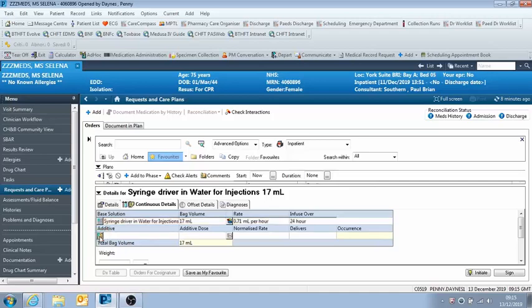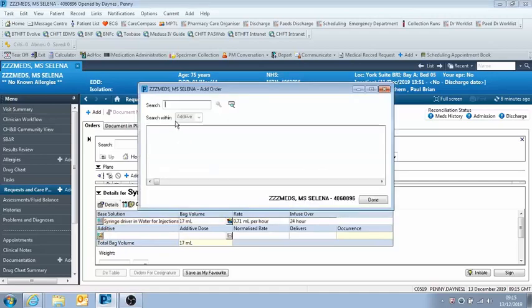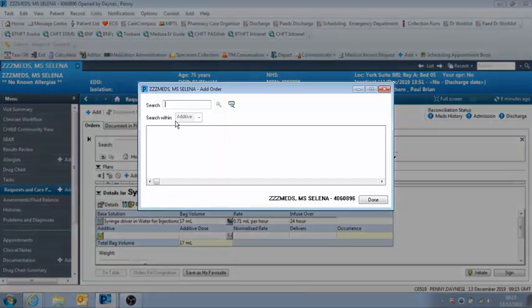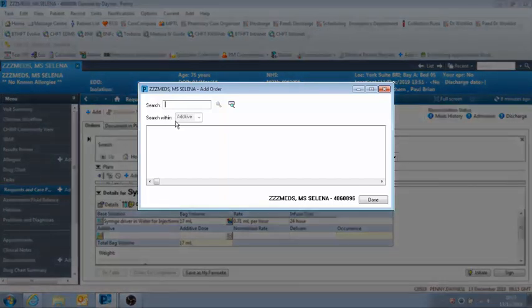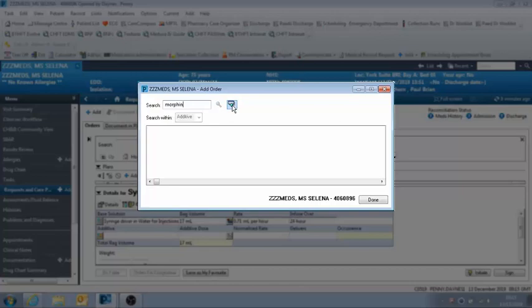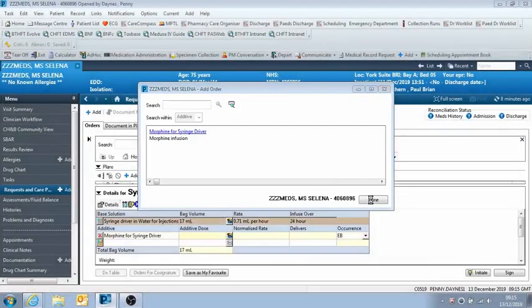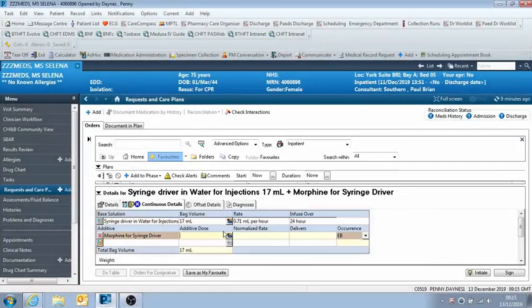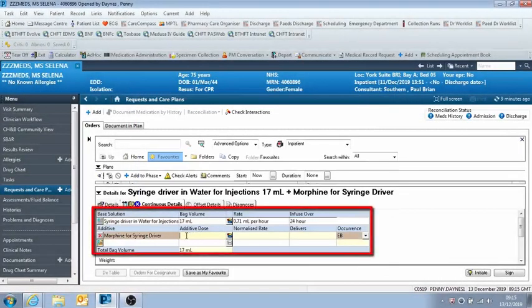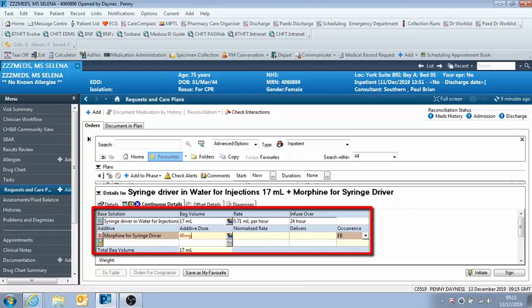So if you just click there, and then we're looking for morphine for syringe driver. So you just need to start typing in your drug. And then if you use this advanced search button here, it will bring it up. So here we are morphine for syringe driver, and then just click done. And then this allows you to enter your dose. So here we're just going to type 40 milligrams.